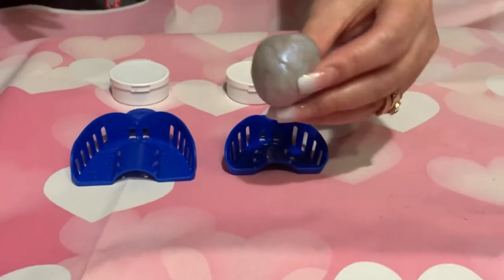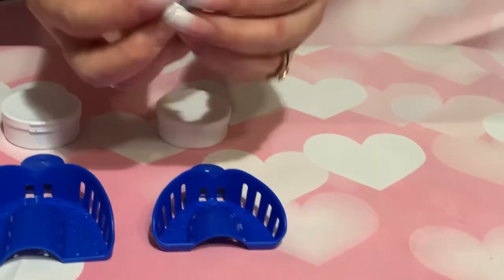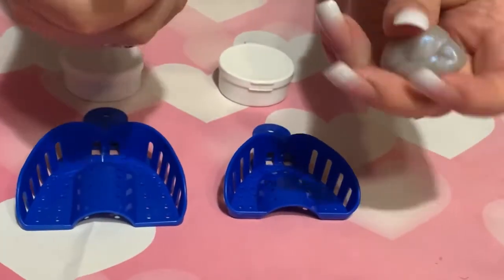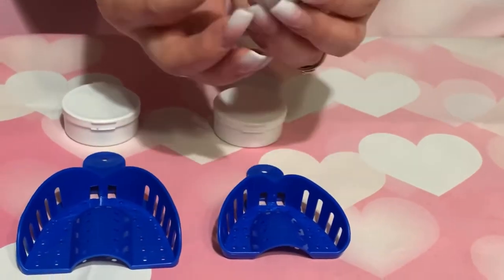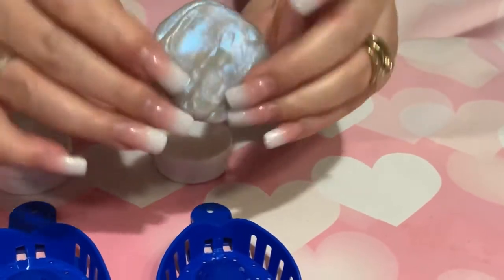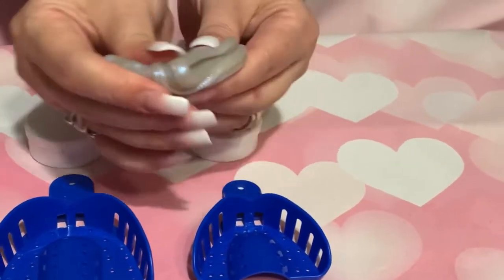So we got putty. You're going to have to forgive me. Even salons are closed, so my nails are not done. They're just growing out. I told him what we're going to do is cut this in half. And I had him practice that one is white, one is blue, even though they're the same color. What you're supposed to do in the instructions is combine them. So I told him you're going to flatten it out like this, both of them together, because then it says bend it and fold it. So I told him just squeeze and fold, squeeze and fold, squeeze and fold.